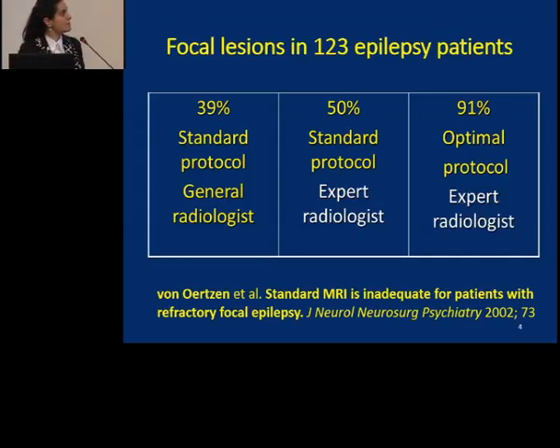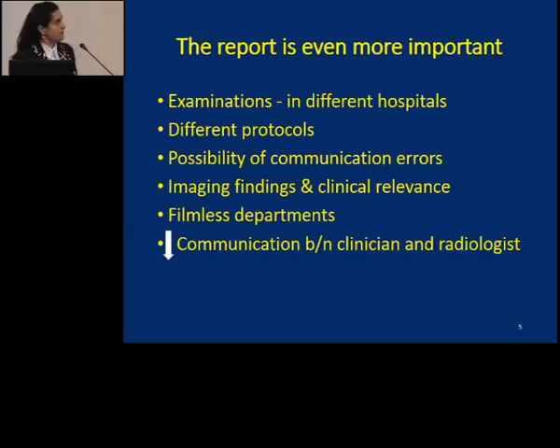I like this study because it summarizes the main information. If we apply the optimal protocol for epilepsy, and if the images are read by expert radiologists in epilepsy imaging, we can achieve more than 90% sensitivity of detection of focal lesion.